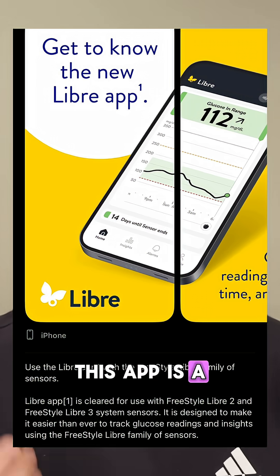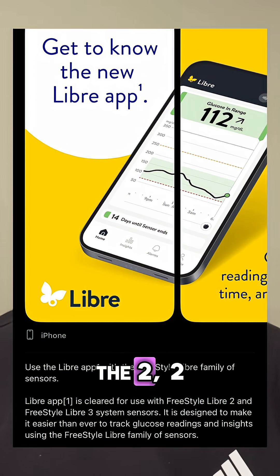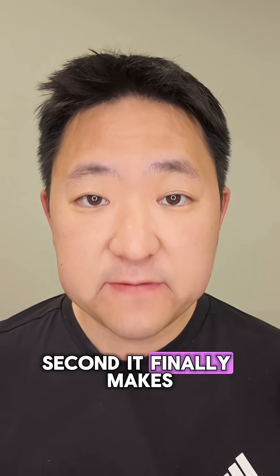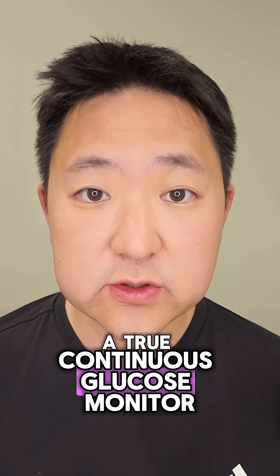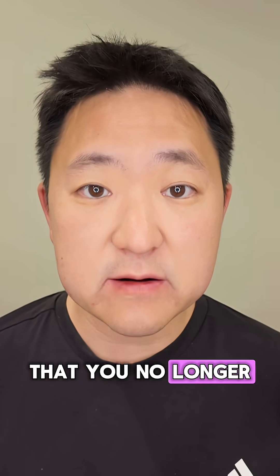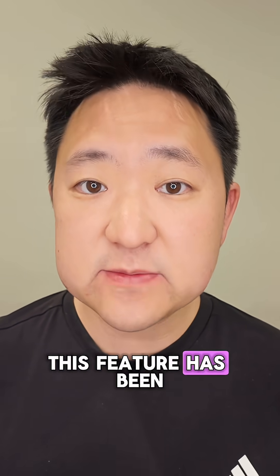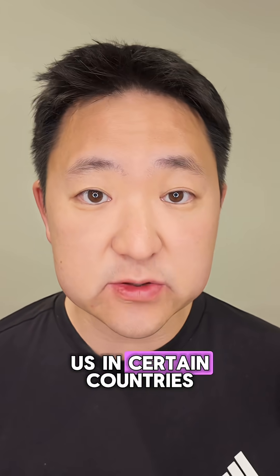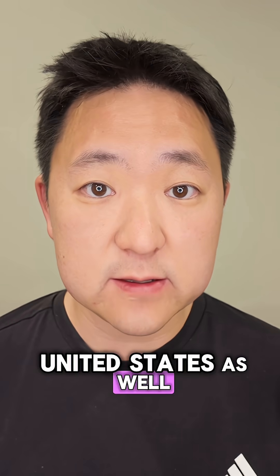This app is a universal app that works with all Libre 2 and 3 sensors — the 2, 2+, 3, and 3+. Second, it finally makes the Libre 2 and 2+ sensor a true continuous glucose monitor, meaning that you no longer have to scan them to get readings using the app. This feature has been available outside of the U.S. in certain countries, but is finally new and available in the United States as well.